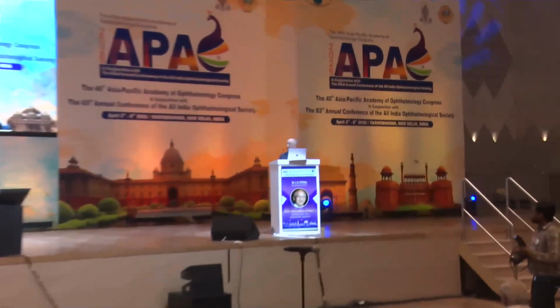I think one comment on this, Rakshit, very nice presentation. Whenever we have a progressive disorder which is causing zonular weakness, maintaining that bag for the long run can be difficult sometimes. So sometimes I would do a good phaco, and if the bag is still there, I'm not very keen to put the lens in the bag in those cases. I might put a 3-piece lens in the sulcus and maybe capture a little bit. Sometimes I don't do capture also, because this bag is not going to be stable. So that can be one option.